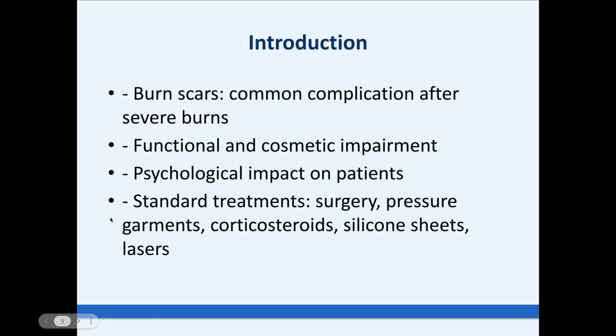Today we are discussing CO₂ laser, but truthfully, we use not only CO₂ laser as monotherapy, but we combine it with other treatments, like steroids, silicone, or pressure garments, and others. I will say more a little bit later.